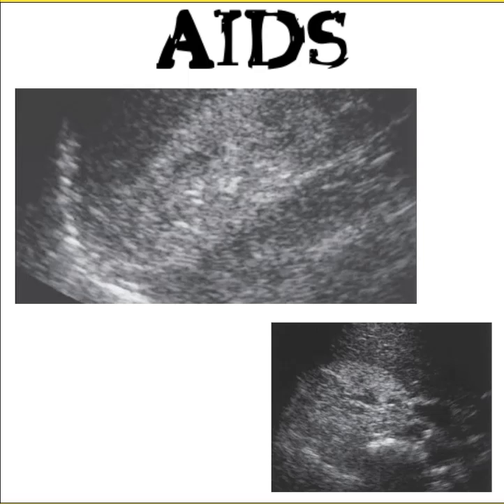You can see how the last four diseases that we've talked about all make the kidneys bright. So that's one thing that keeps them similar. But the thing that makes them different from one another is that lupus includes small kidneys, where the other three were big kidneys. Lupus has thrombosis, where the others do not mention that.